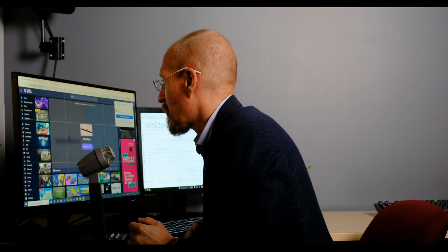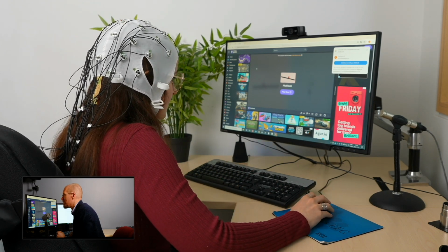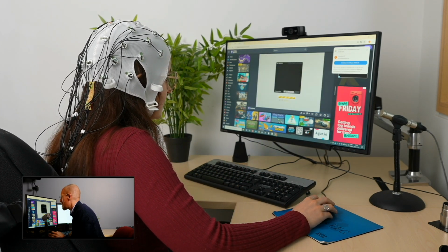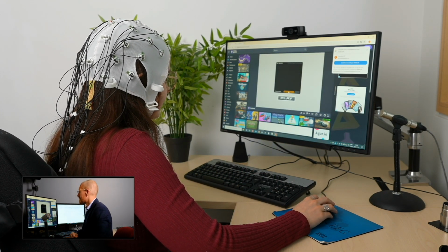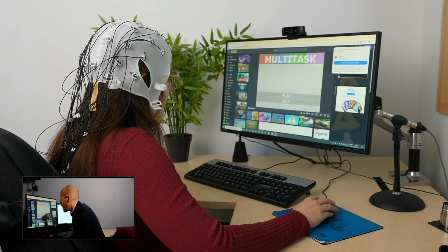So Anne, we're going to try this. Go ahead and press play now, and we'll read the instructions together. Okay. Please press play and play.